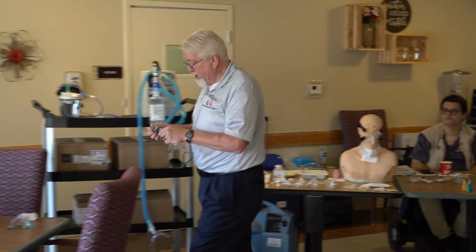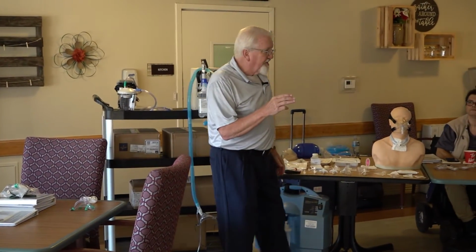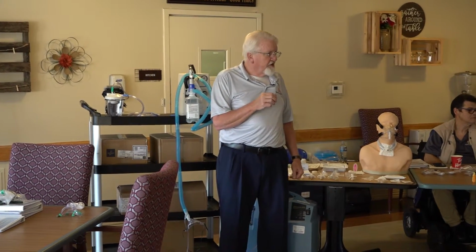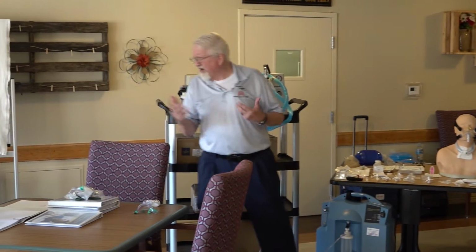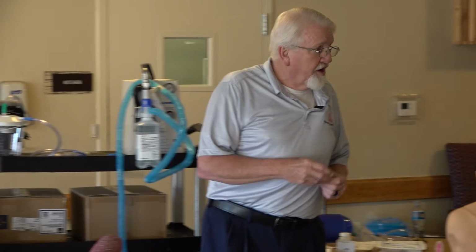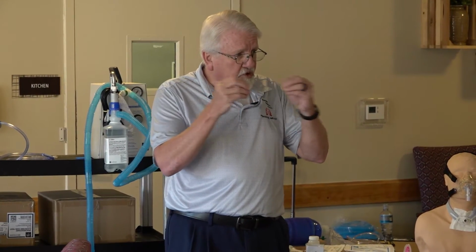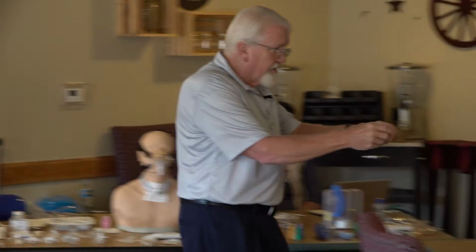If you'll look at the numbers on the side, you're going to have 3 FiO2 percents for 3 liters, which is going to be, what, 24, 28, 31, and 35 or something like that. And then on the bottom side, you're going to see you have 3 FiO2s for 6 liter flow. And that's going to be 35, 40, and 50. You notice you can pull that apart. It's spring loaded. What you're holding right there, pull. No, there you go.